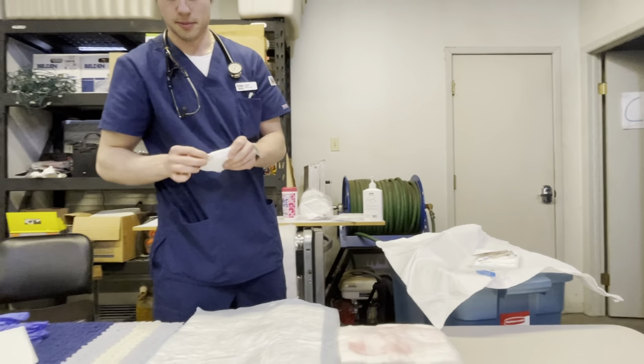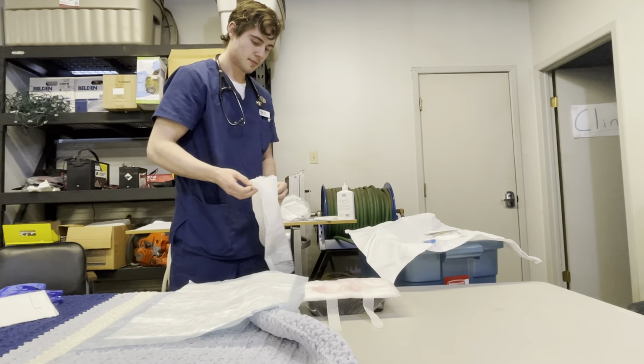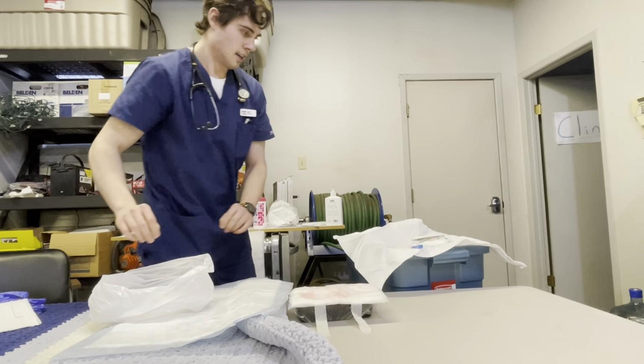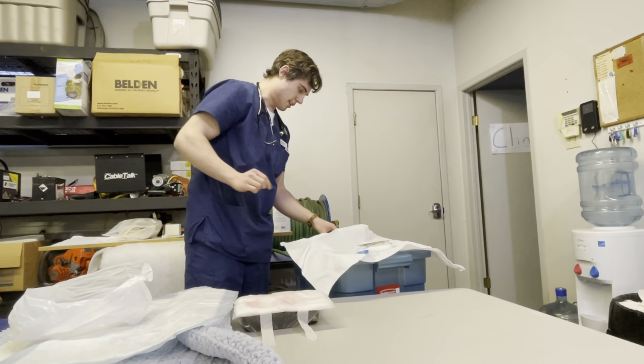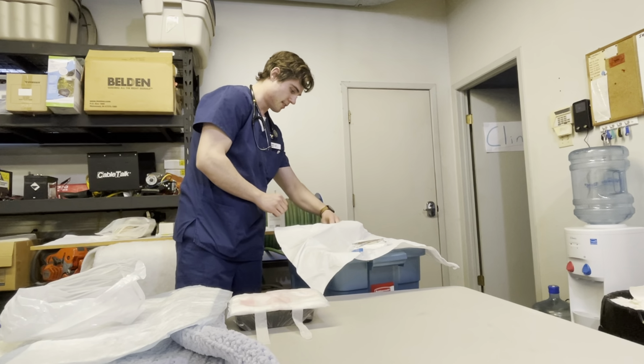I'm going to take out the garbage bag and I'm going to ask the patient if it's okay if I set the garbage bag up between their legs. They're okay with that. After that, I'm going to start adding. So I've got my ruler. I'm going to set that up beside the patient there.